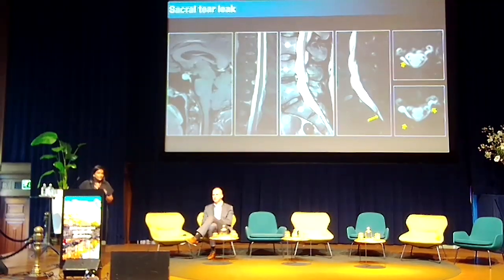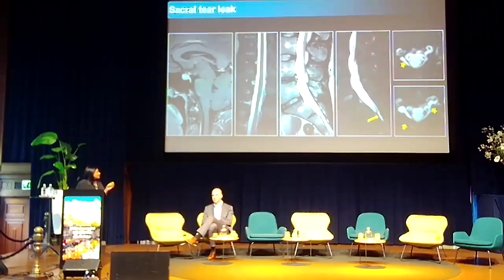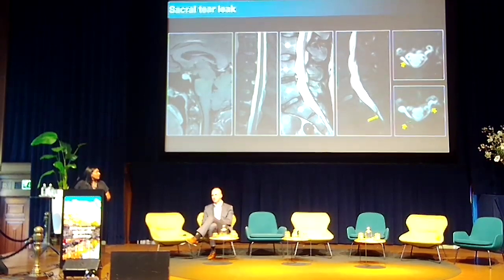You can see that this patient initially has signs of SIH, subtle brain sag, pituitary distension. And what you can see here is that she has the dorsal epidural fat edema. She got a little bit better, but came back and her MRI at follow-up was read as normal because there wasn't that much fluid left. But what was missed was the small amount of fluid in the sacral cul-de-sac. And when we reformat that, you can see that there's still epidural fluid in that sacral region.